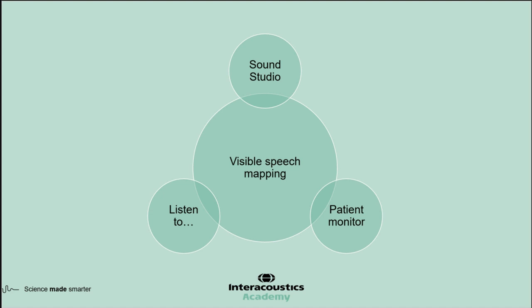So for you as the clinician to have the ability to listen to their hearing aids and to know what they're trying to explain, I think that's a great way of building rapport and then fine-tuning and making adjustments. And again, I think it helps that patient, that client, to feel really involved. And again, it's about sharing the experience that I mentioned a minute ago. This is also a great tool for allowing loved ones, parents of children or caregivers to listen to the hearing aid so that they know what it's doing, and then they know either the limitations of it or where their role can become involved.